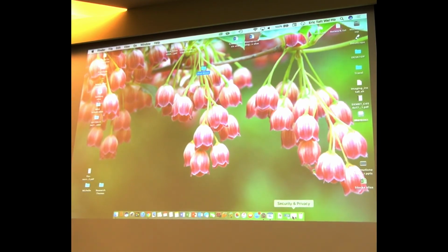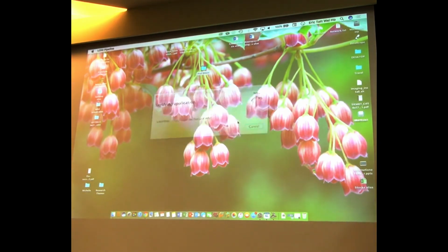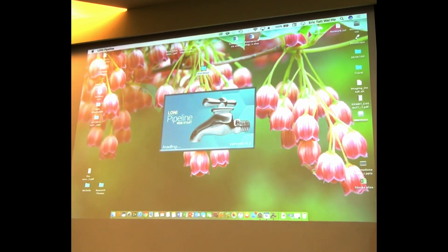Okay, but now, Eric, how do I reopen it? Oh, is it this one? Okay. Also, does it need to re-download it? Oh no, it's already here.